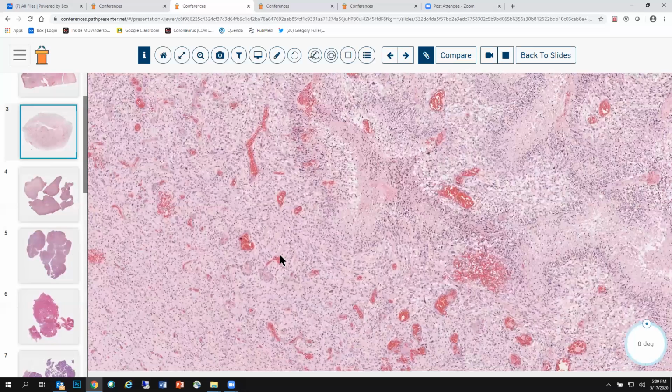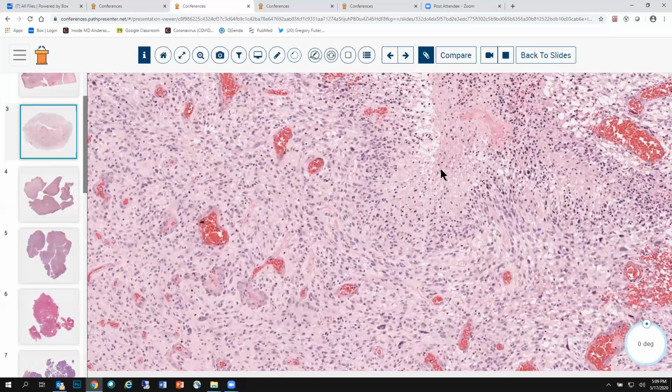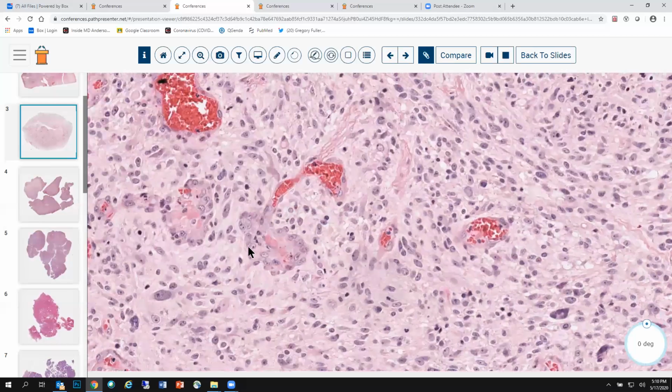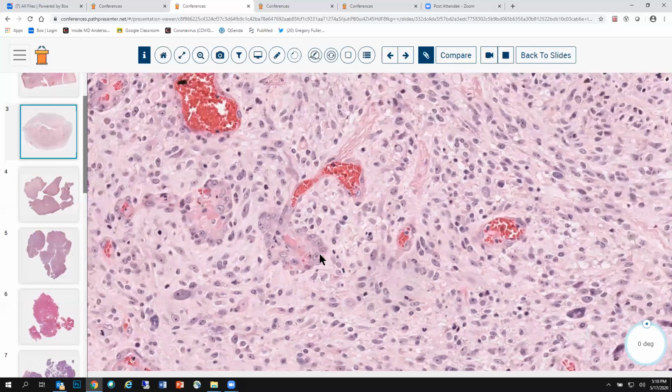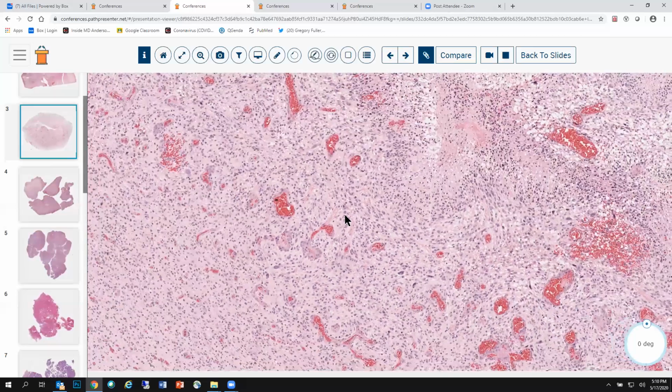Intravascular fibrin microthrombi in a glioblastoma are strongly correlated with IDH wild type genotype. Another key feature that we see here, here's necrosis, pseudopalisading. These cells would be hypoxic. They would be secreting VEGF, vascular endothelial growth factor, into the environment, which would stimulate the proliferation of adjacent capillaries. And sure enough, look at this beautiful vascular proliferation. That is another hallmark feature of glioblastoma.